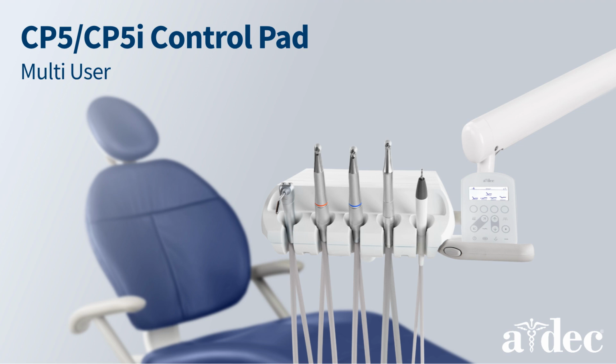In this video, we'll discuss multi-user on a CP5 or CP5i control pad. Note, multi-user is only available on delivery units that have been registered to an A-dec Plus account. Available users can be added and removed by the clinic's admin.